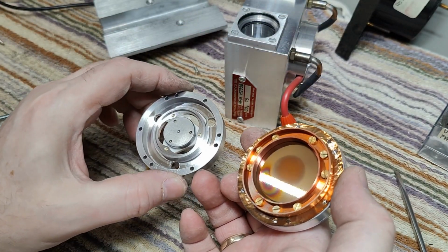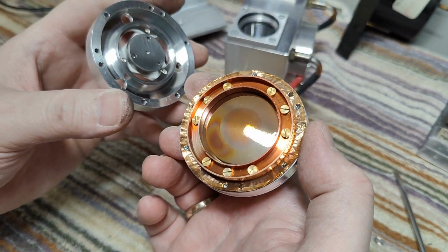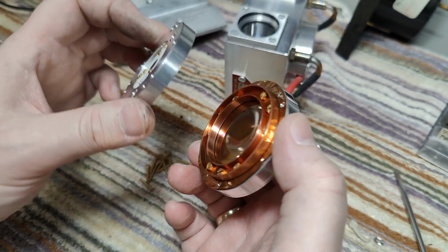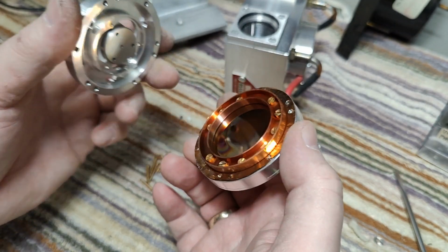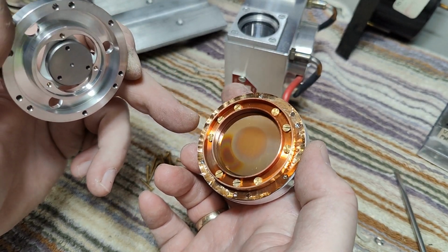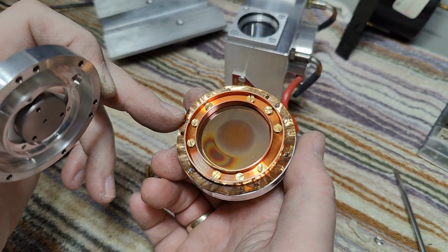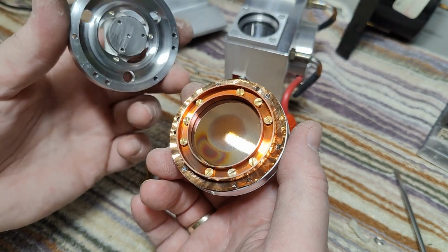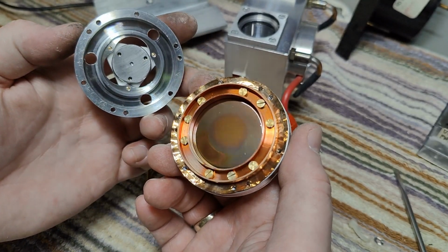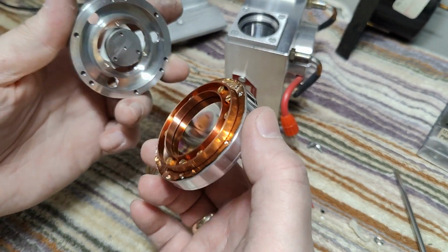It is getting more and more interesting. But now it makes a lot of sense. Remember, I said there's a connection on this side and on the bottom side here, right? And in the middle, there is this little membrane made of the thinnest little something that is conductive, probably like a copper foil or something like that. And this looks exactly like a capacitor, a condenser microphone. If you've ever taken any of these apart, you'll see there's a membrane and then there's a contact.